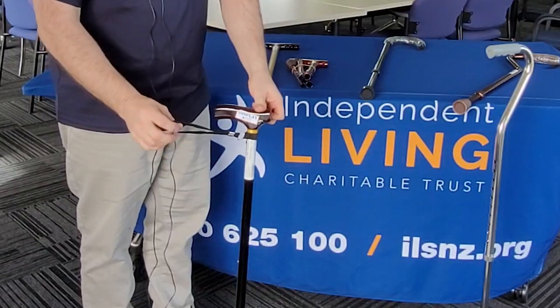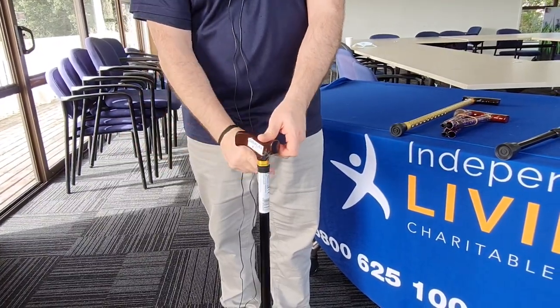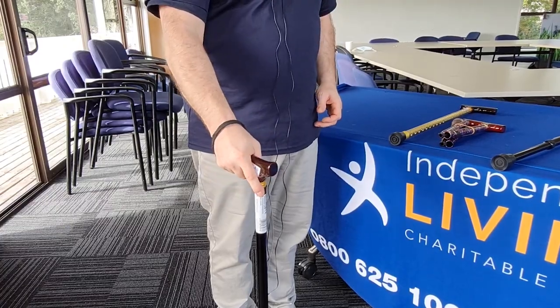The other item that we sell with the stick — for some people if they have an issue with gripping — is just to have this support wrist strap, so that should their grip become loose they're not going to lose the stick.